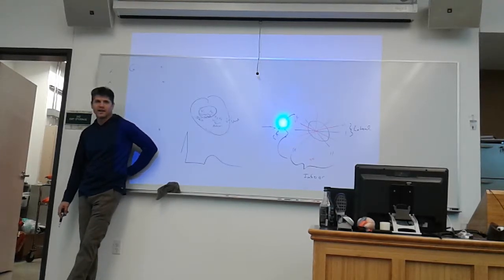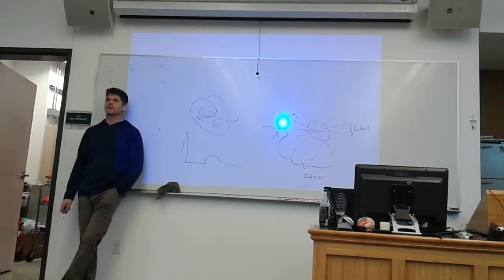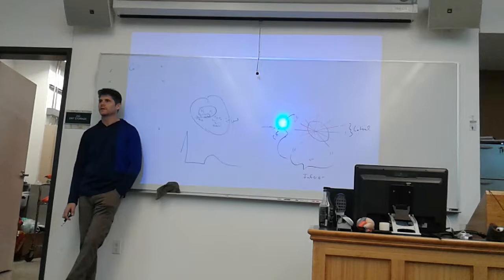Which leads do you take? It doesn't matter at that point in time. Usually we'll just move V4, V5, and V6 to 7, 8, and 9. So then you don't have a lateral showing up in 4, 5, and 6.